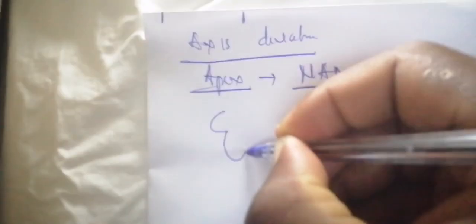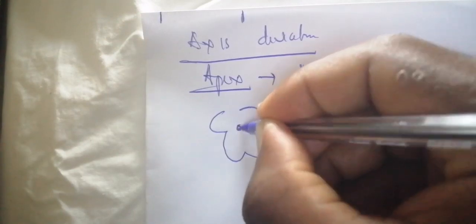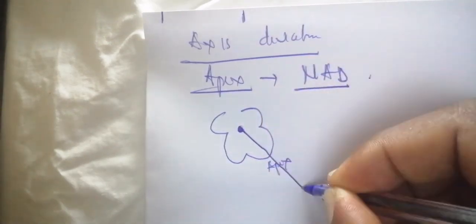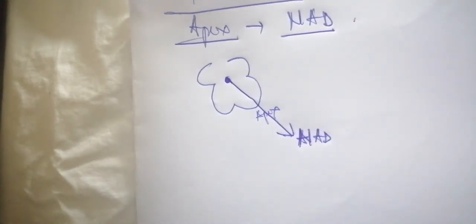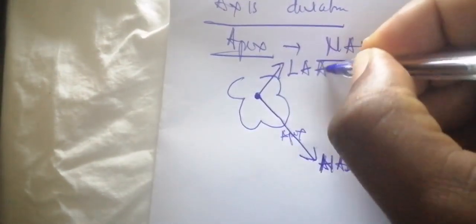So when the wave of the heart goes to the apex, it corresponds to the normal axis deviation. Let's say that you have your heart as such. Is it clear? Let's say that this is the center, here's the apex. The resultant wave must go in this direction toward the apex, and this direction is the direction of the normal axis deviation. Is it clear? Now, if the resultant wave goes more in this direction, you have more of a left axis deviation. If it goes more in this direction, you have a right axis deviation.